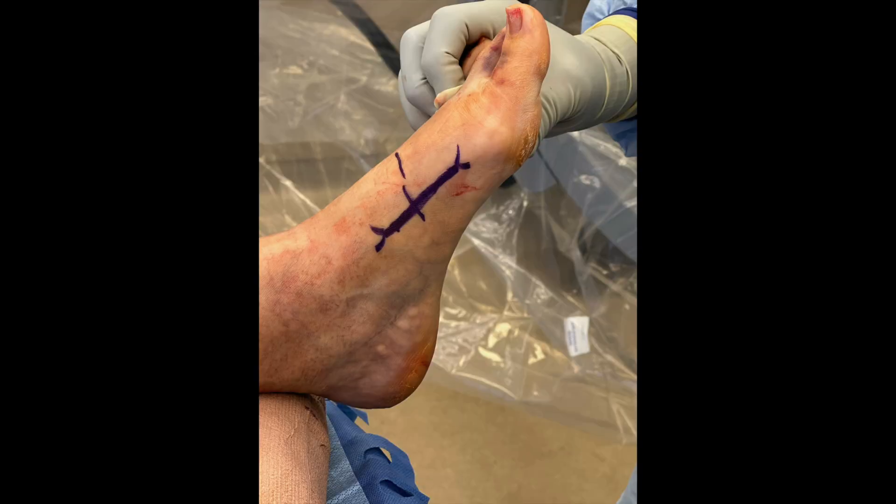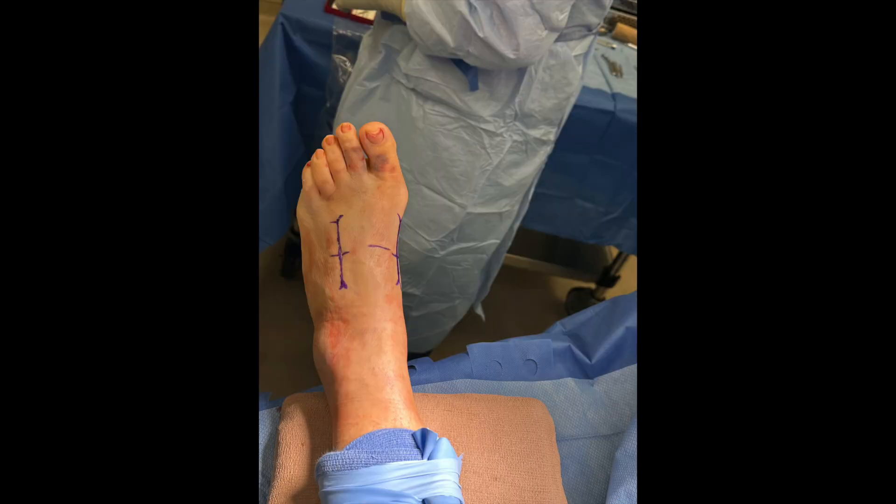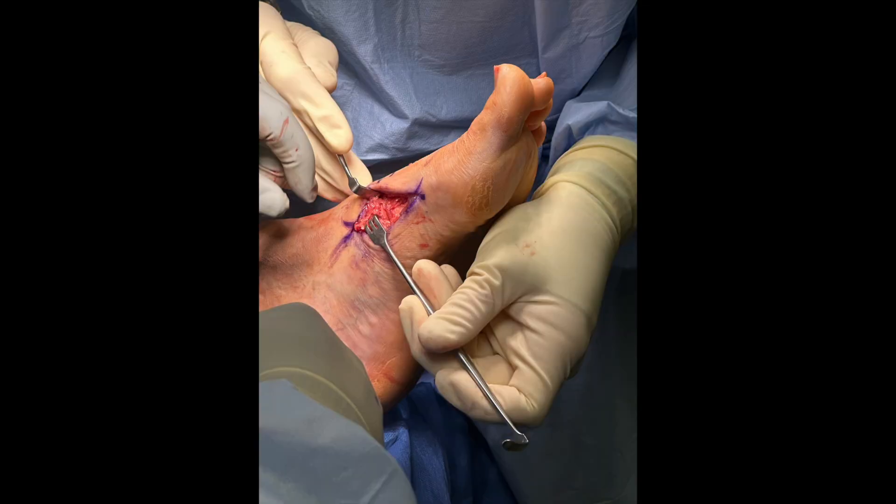Incisions were then planned using fluoroscopy: one over the dorsal medial first TMT joint and one over the interval between the second and third TMT joints, while allowing for a generous skin bridge. Standard approach to the TMT joint was then performed and retractors are placed.